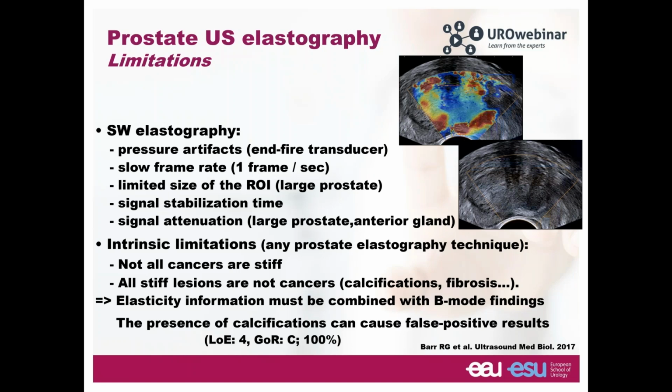And as I told you, not all prostate cancers are stiff, and not all stiff lesions are cancers, and this particularly means paying attention to calcification. As you can see in this other example, you see the stiff area, but just look at the B mode, and this is a very obvious calcification.